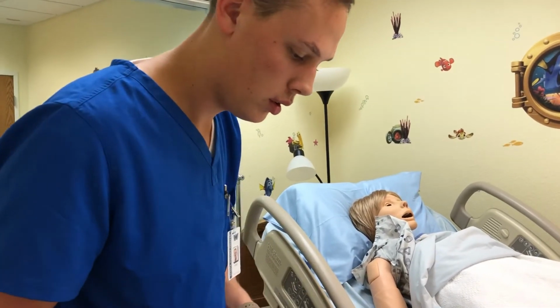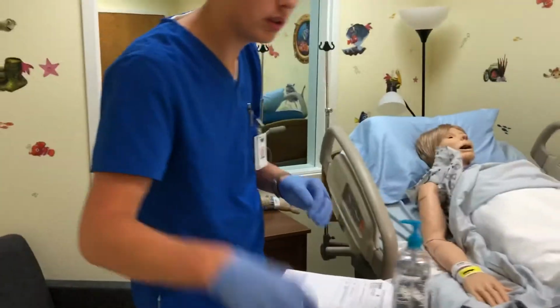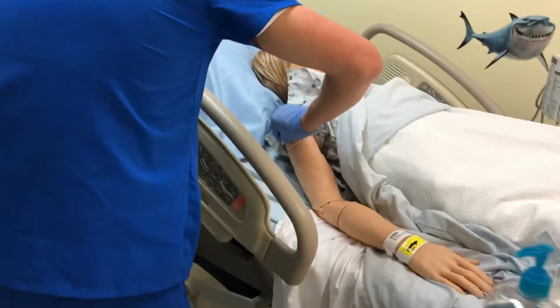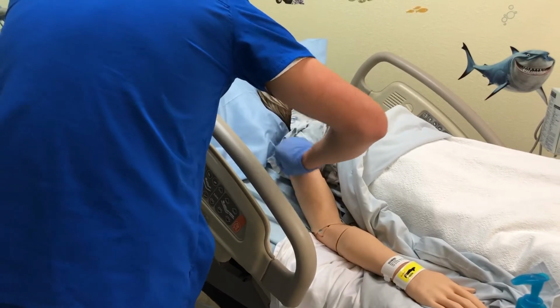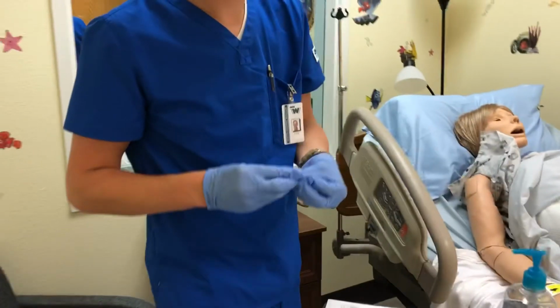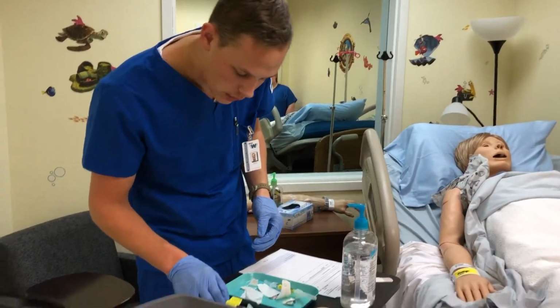Okay. And before I do that, I'm going to wipe down the patient's arm, starting in the middle and going out. And then I'm going to check again.